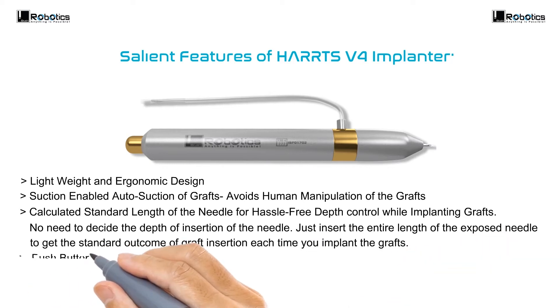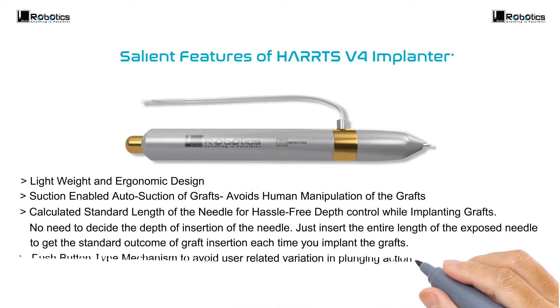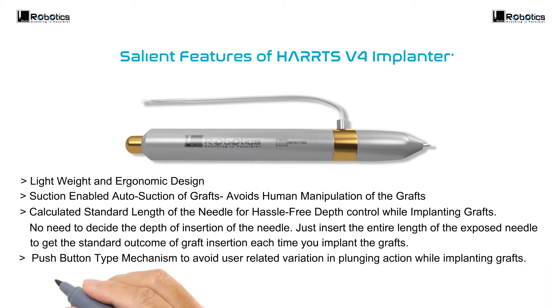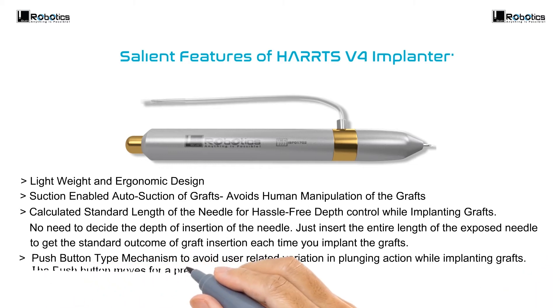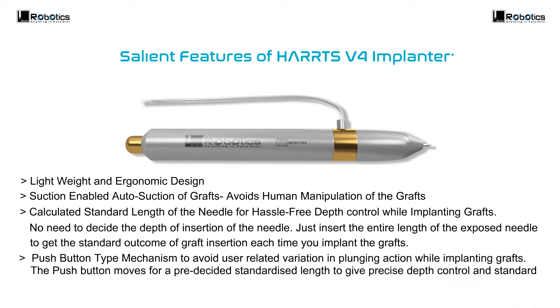Push button type mechanism to avoid user-related variation in plunging action while implanting grafts. The push button moves for a pre-decided standardized length to give precise depth control and standard results with each implantation.